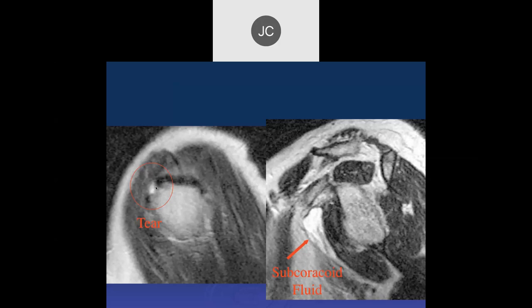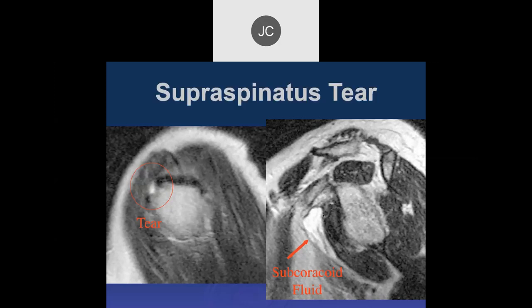My guess is that joint fluid goes through the tear in the supraspinatus into the subacromial/subdeltoid bursa, which communicates with the subcoracoid. In the upright position, fluid will drain into the subcoracoid, so sometimes you won't see an effusion in the subacromial/subdeltoid bursa. The acromion on this image — we're too medial to be including the distal clavicle and acromion here.